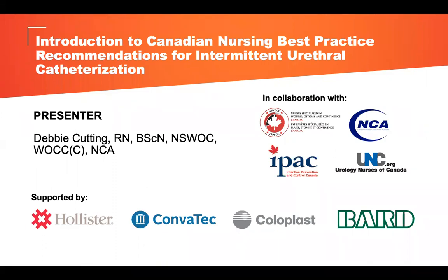Yeah, I don't know if we can make extrapolations to other types of urinary diversion or continent catheterizable stomas or that type of thing. But I do think that those patients face many of the same challenges where they're going to be chronically colonized. They're having to traverse, whether it's a conduit, it's a little bit more curvy. If they have to pass, say, a nipple valve inside. So again, they're not a group of patients who should be discarded. They're unique to your sort of neurogenic, non-neurogenic group, but they do also, I agree with you, have very similar struggles.